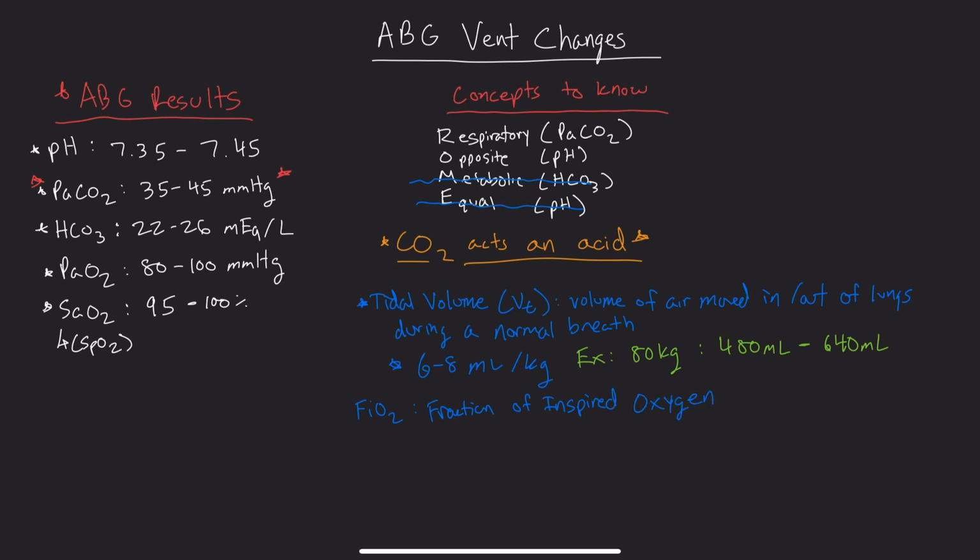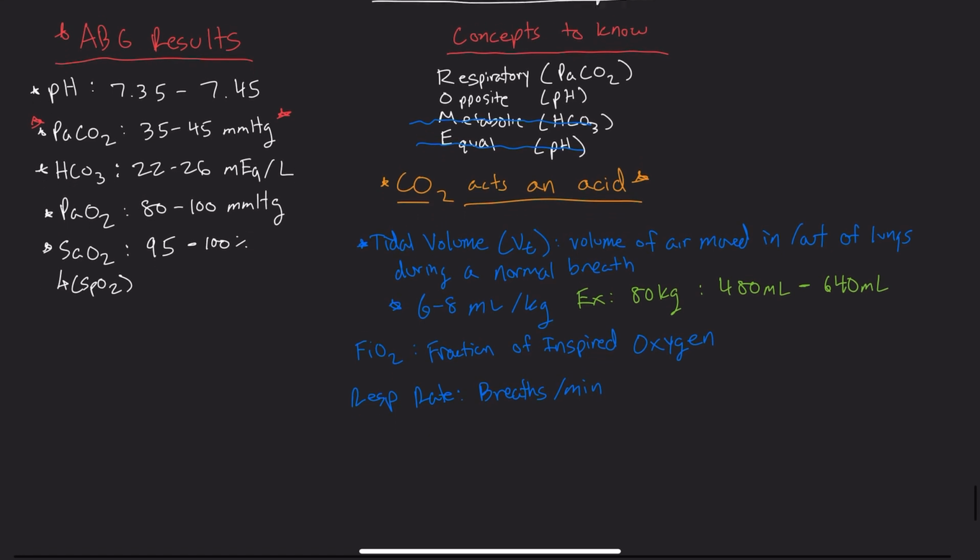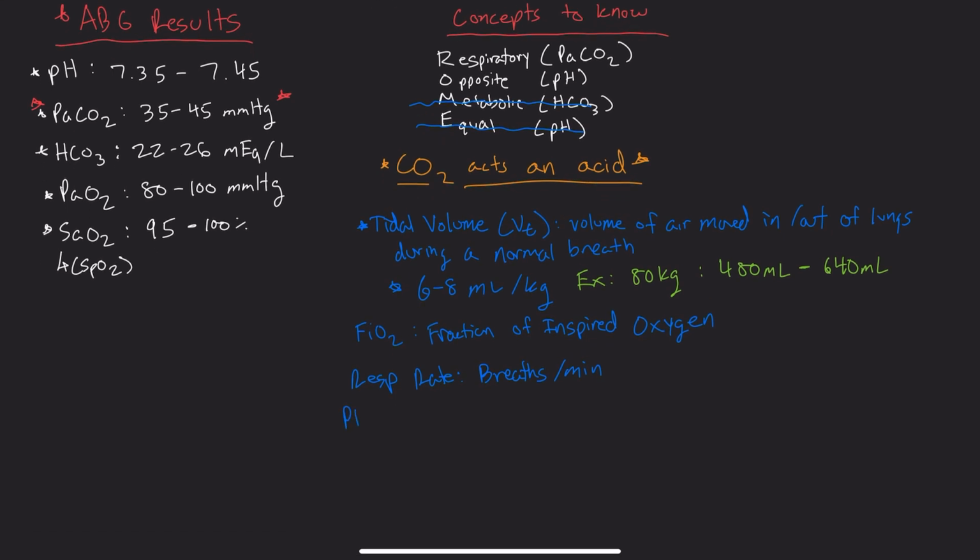Other one we need to know is pretty simple here, just the respiratory rate. That's just measured in breaths per minute. And then lastly, we need to be familiar with PEEP. PEEP is positive end expiratory pressure.